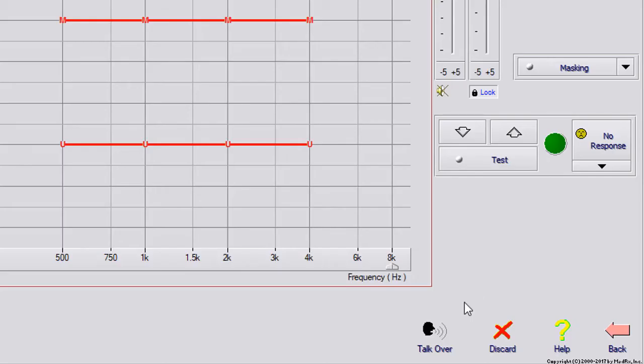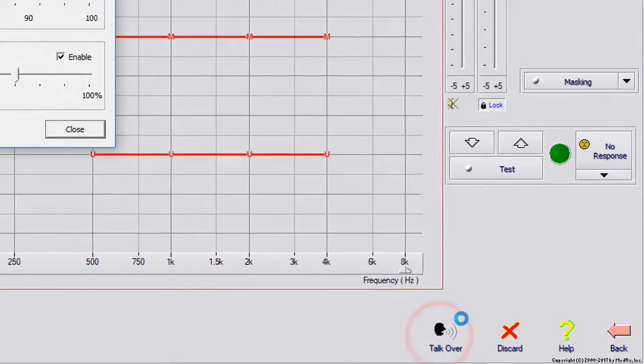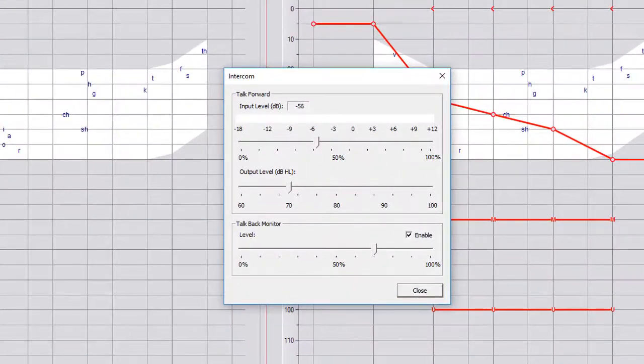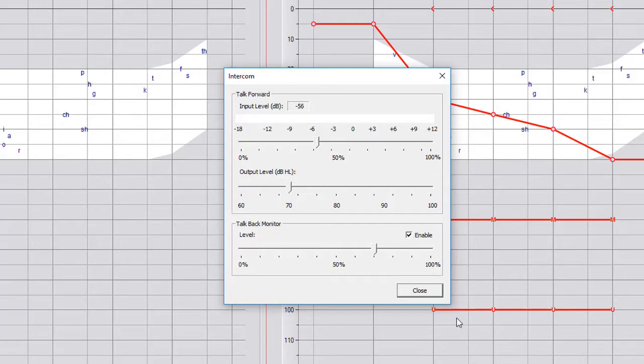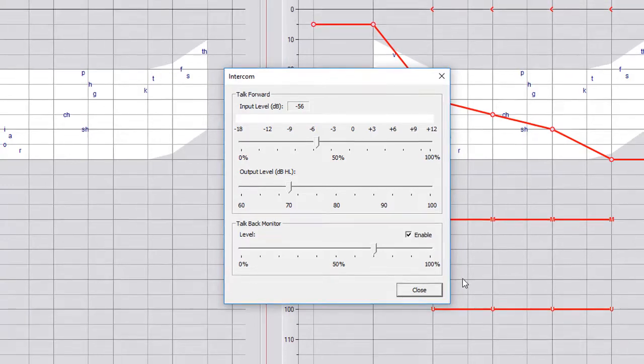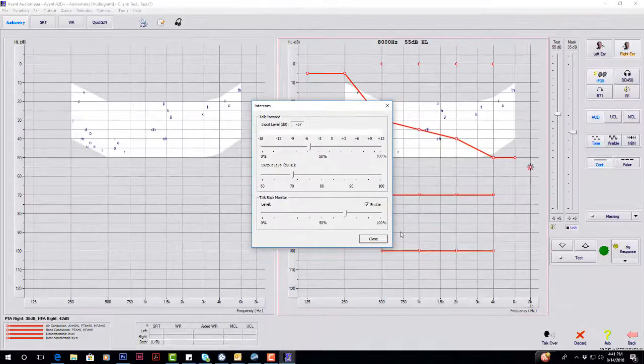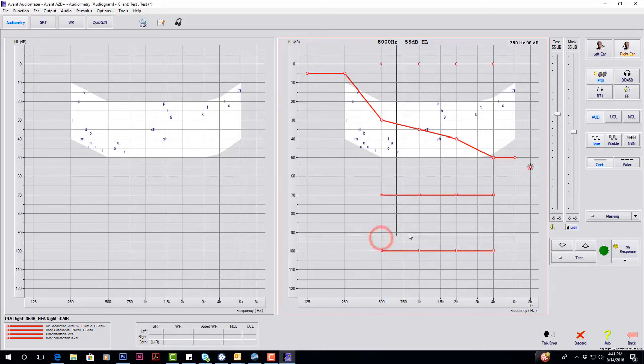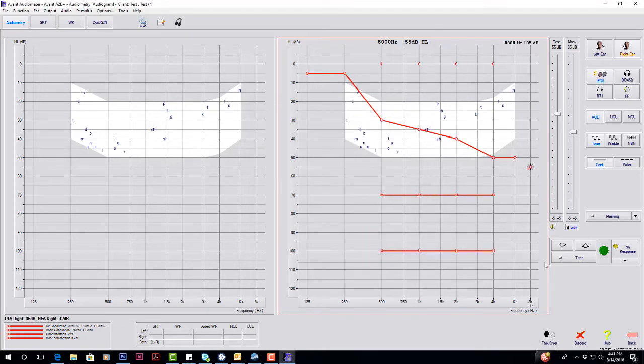On the bottom right, we have talk over. So anytime that you're wanting to talk to the patient and give them instructions, you're going to select talk over and have this window open. As long as this window is open, the patient can hear you. Once you close that, the patient cannot hear you.